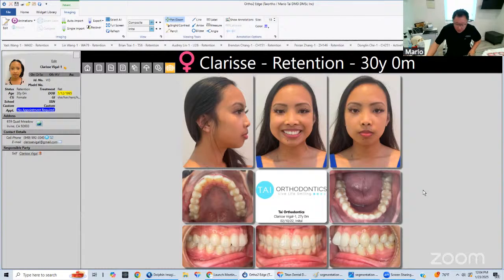Thank you so much for joining this webinar today. Today I wanted to show you guys how to set up a case in a time frame that I would do it within the hours that I'm working.